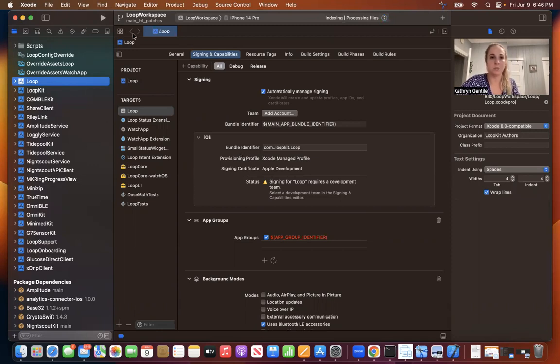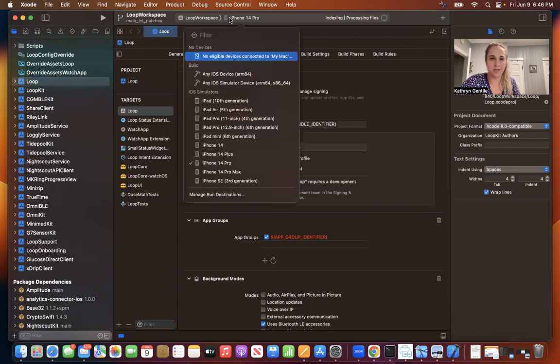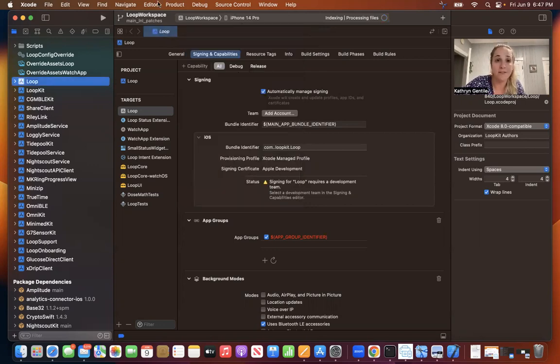And then once your phone is plugged in, you are gonna come up here. And you no longer have to select loop workspace if it's been a while since you built your device. My phone's not plugged in, that's all, but it will come up right here. If it says like not ready for build or developer mode disabled or something like that, you need to go back onto the docs and follow the steps to turn on developer mode. It's in your iPhone settings under privacy and security. You will have to restart your phone after that, but you'll go in, you'll select your phone. And then all you have to do is hit that play button and it should build.